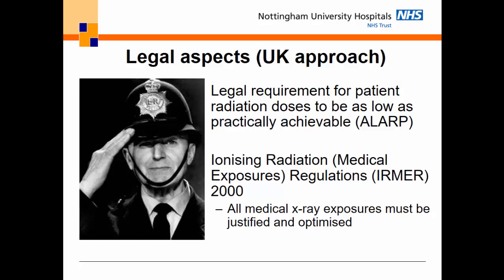It's what is sensible. We also have in the UK regulations called the Ionising Radiation Medical Exposures Regulations, known as IRMER, and that basically says that all X-ray exposures must be justified and optimised. Again, that applies pretty much across the world, and certainly in EU legislation, and that legislation is going to be beefed up come 2018.